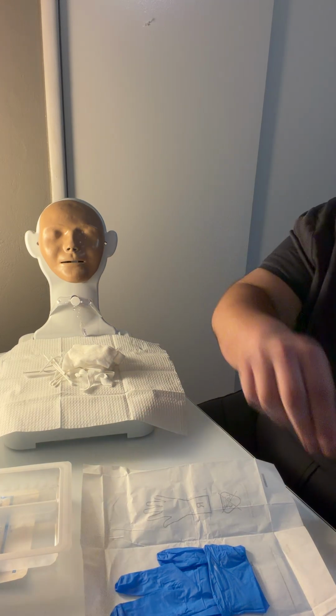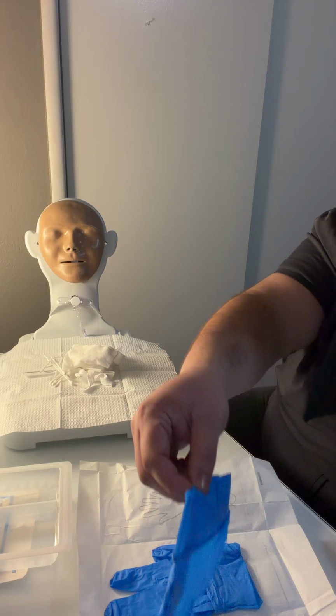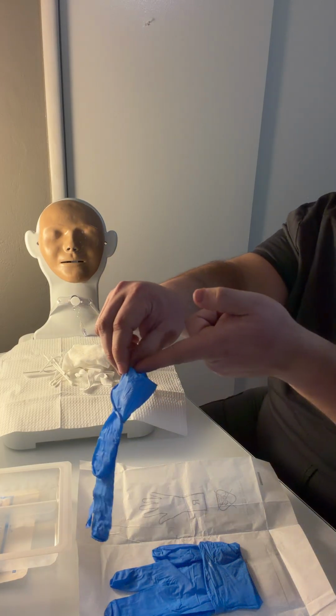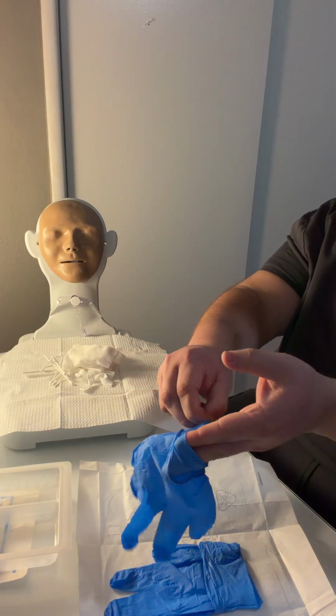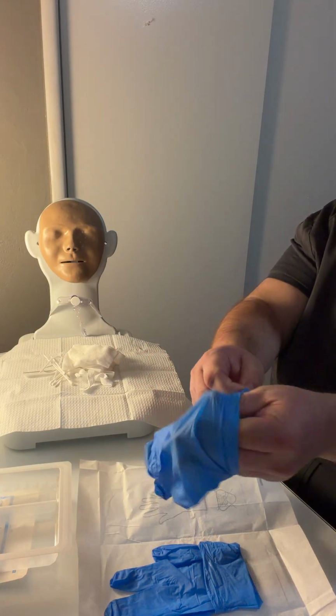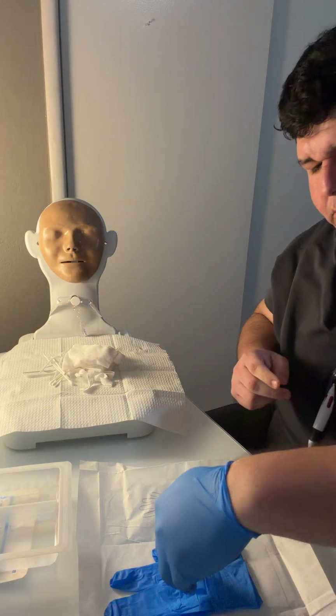Using the 3-finger method, I'm going to pick up here. Then I'm going to scoop.